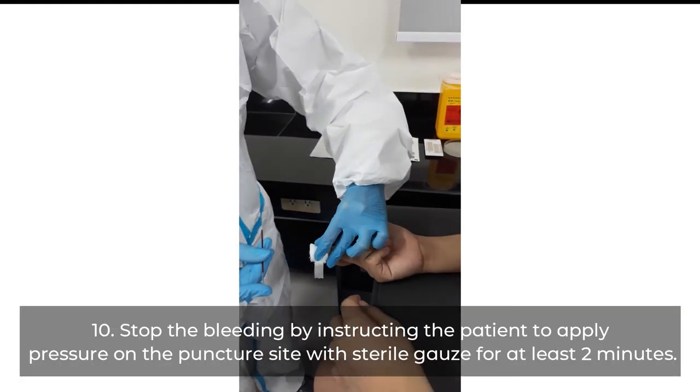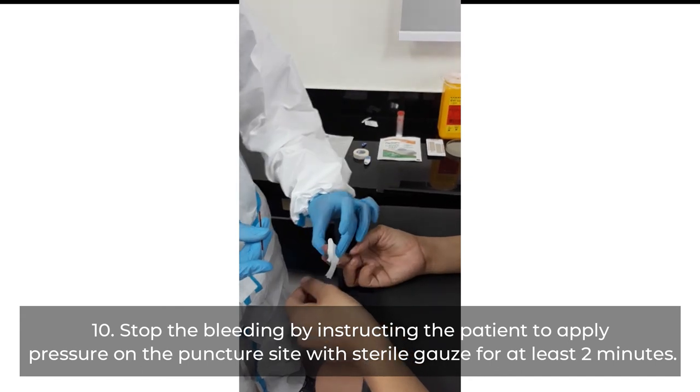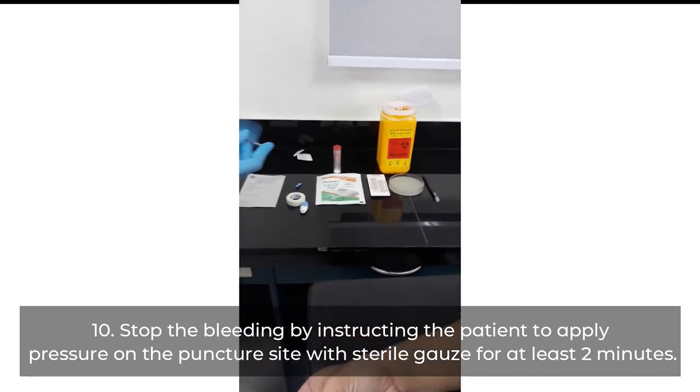Stop the bleeding by instructing the patient to apply pressure on the puncture site with sterile gauze for at least two minutes.